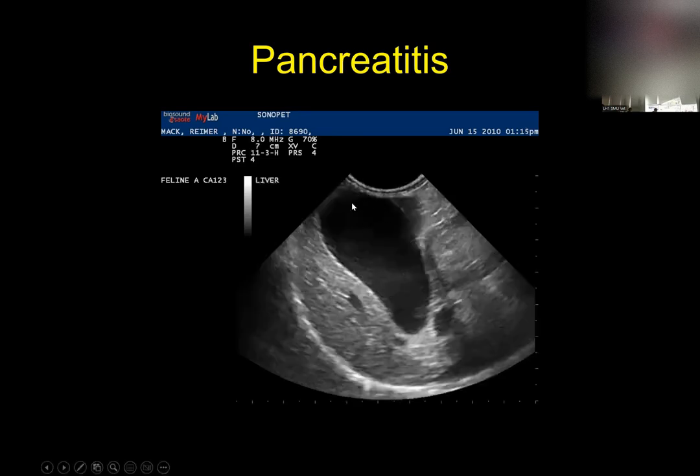And again, sometimes the gallbladder gets really big, but do not think that just because you see an enlarged dilated gallbladder, the dog automatically has pancreatitis. We said when we talked about gallbladders, the gallbladder can get big, and then once you eat, it contracts and squishes out the majority of the bile that's in it. So big dilated gallbladders, you can see with pancreatitis, but you can also see big dilated gallbladders that don't mean anything at all, okay?